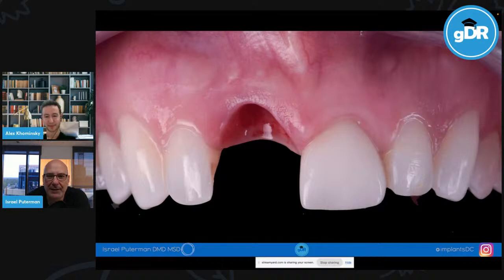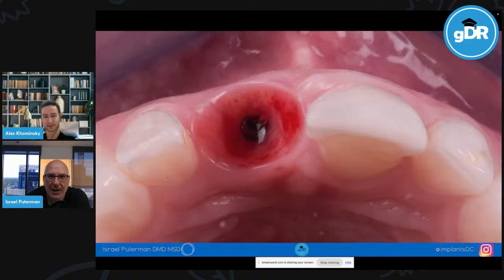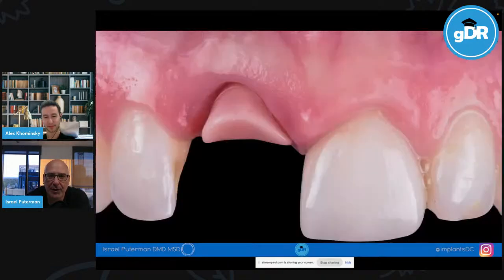But I look at the clinical situation, removing the crown, and this is what I have. There's some loss of facial contour. There's obviously a vertical loss. Thankfully, I still had that customized healing abutment. I don't usually keep that, but we did still have it. I put it back in, and you can see the deficiency of where the tissue was to where it is right now.